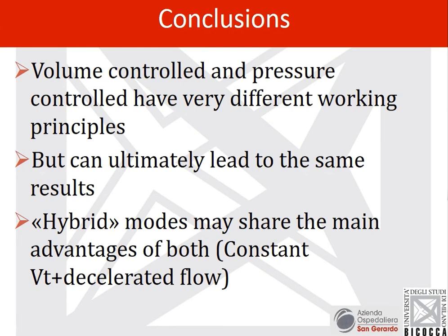And I would reinforce the message I gave you before, that it is crucial not just to connect the patient to the ventilator and see that peak inspiratory pressure is 28, so we think it's safe, but it is crucial to monitor plateau pressure and driving pressure and compliance to tailor the mechanical ventilation to our individual patient.